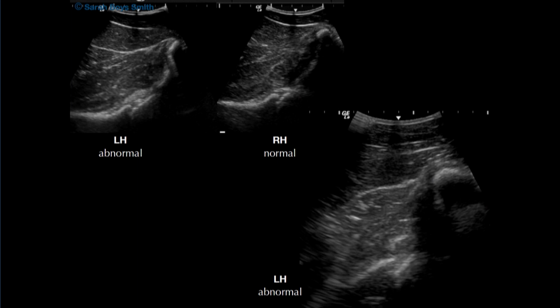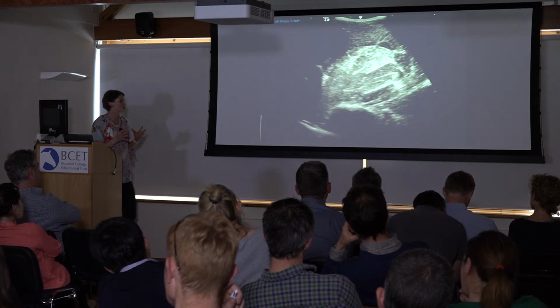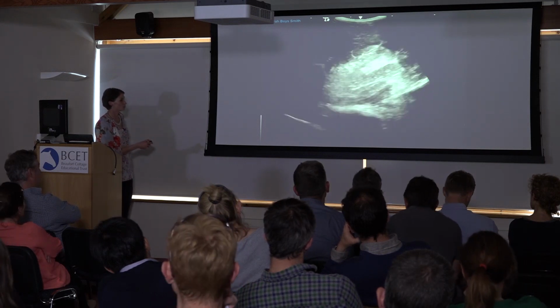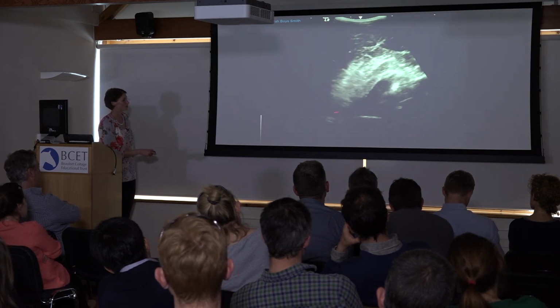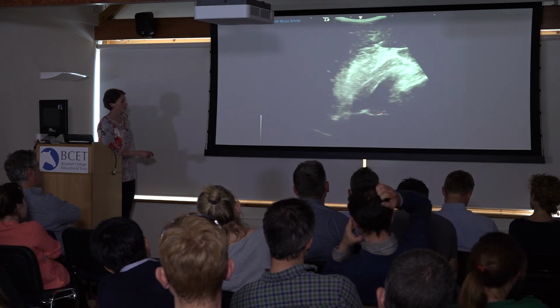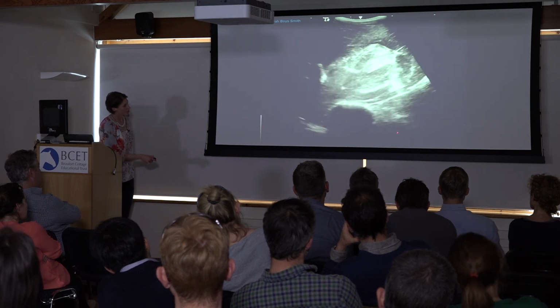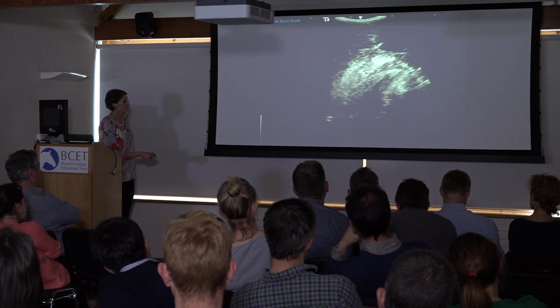This was a little yearling that presented with very acute lameness. When you cracked on its pelvis, the whole bone's just cracked. So it was obviously something grossly abnormal. From an ultrasound point of view, we've got our ilial shaft coming here, but the acetabulum is positioned up here. And the femoral head is also sort of going off more at an angle. It's curving down here more. It should be positioned more in that orientation here.